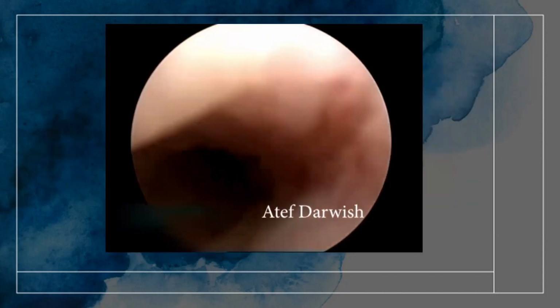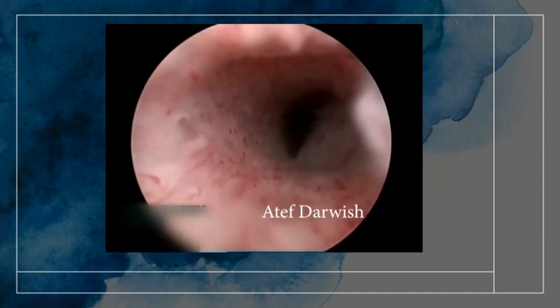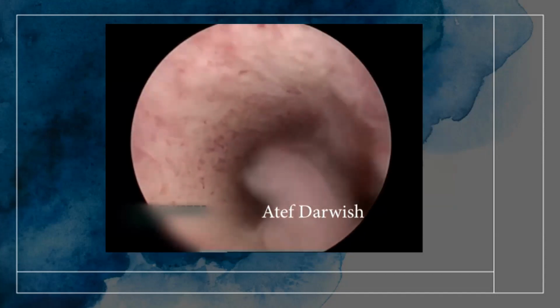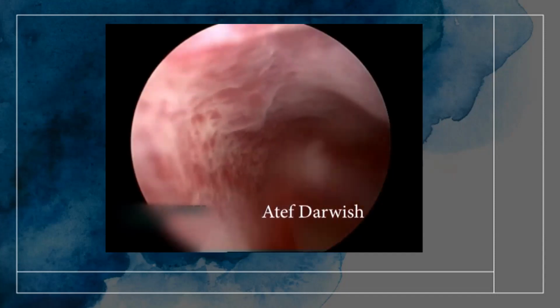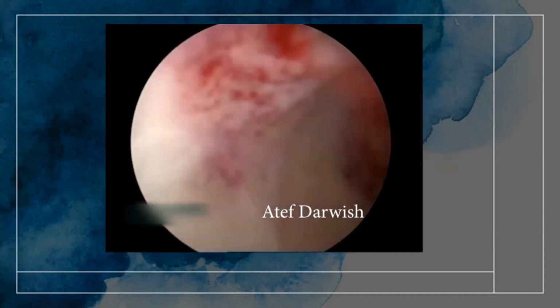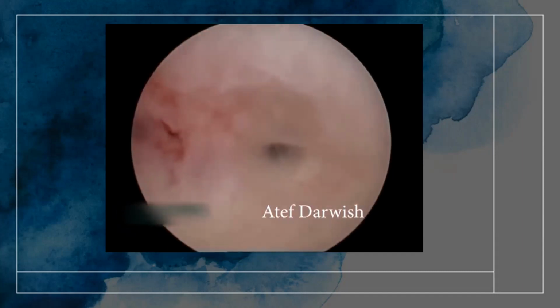Here you can go by diagnostic hysteroscopy into the endocervical canal, and with a gentle approach, you can see the internal os of the uterus, and some endometrial shreds are seen. You are approaching the endometrial cavity. Here on the left side of the patient, you can see the tubal ostium covered by some endometrial shreds, but it looks normal.